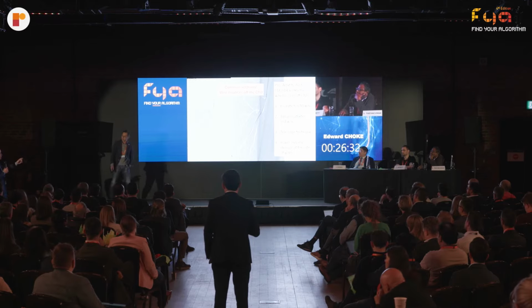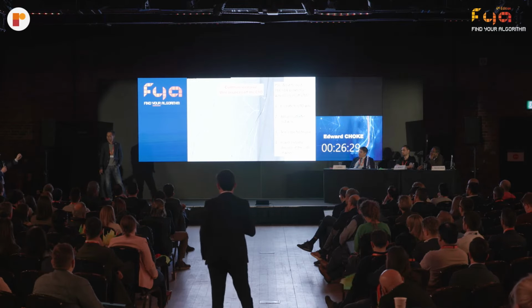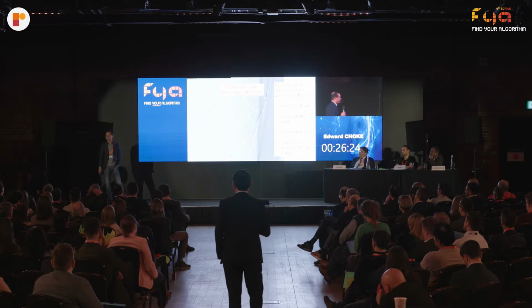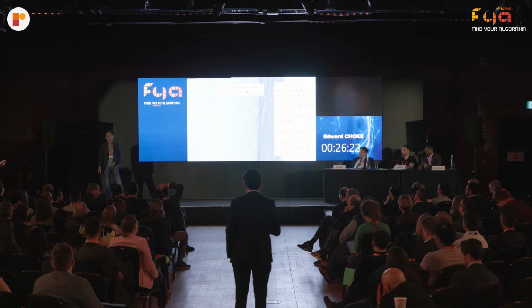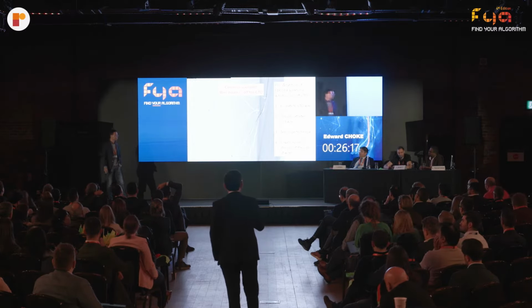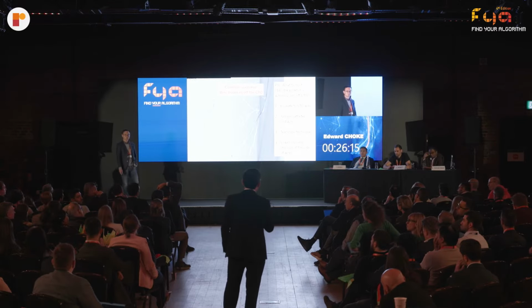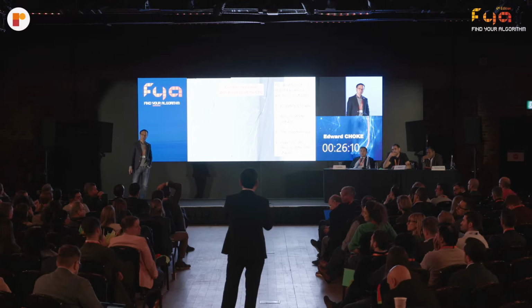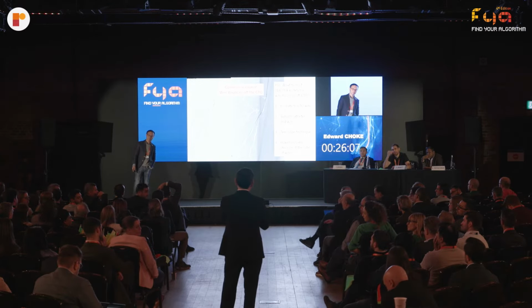Yeah, but we also need to think that many long CTOs are not all CTOs. There's a little cap, maybe, and then for all the rest the guide wire moves super easily and nicely. So we need to realize that sometimes what we see is not what it really is. We tend to say that if the wire crosses straight, we are intraluminal, whilst if it crosses in a loop, we are subintimal. And it's not the case in both. You can loop but have a microchannel intraluminal. You can go straight but be subintimal.